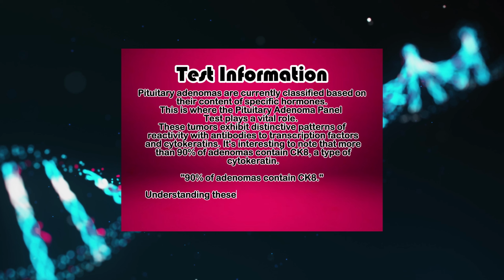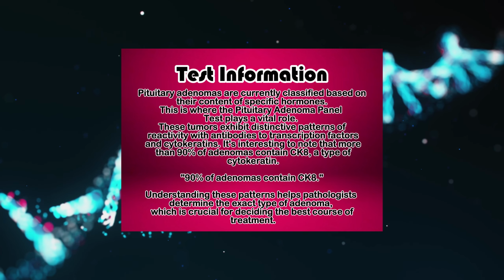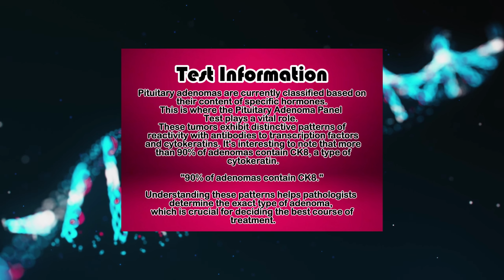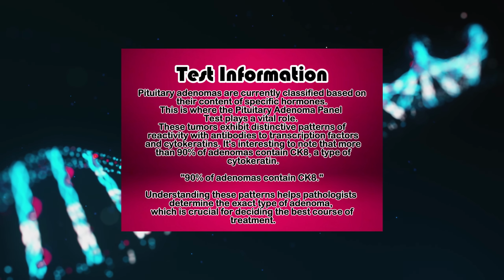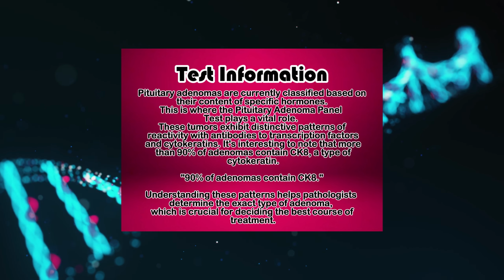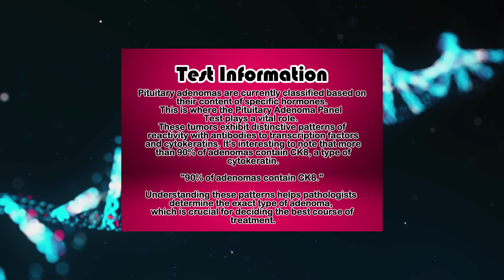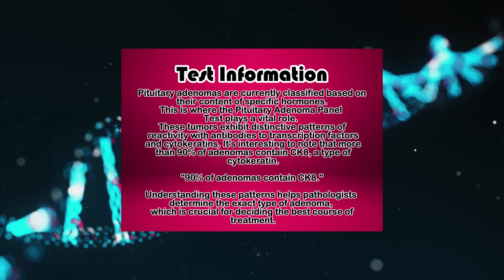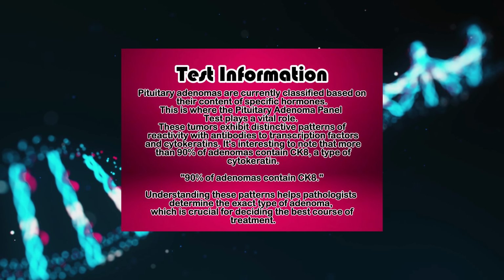General test information. Pituitary adenomas are currently classified based on their content of specific hormones. This is where the pituitary adenoma panel test plays a vital role. These tumors exhibit distinctive patterns of reactivity with antibodies to transcription factors and cytokeratins. It's interesting to note that more than 90% of adenomas contain CK8, a type of cytokeratin.